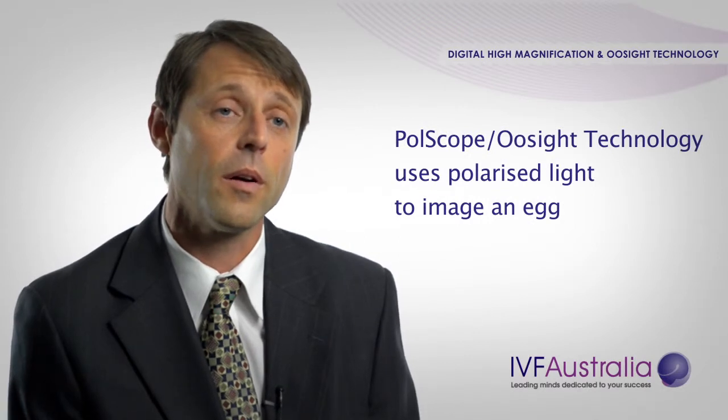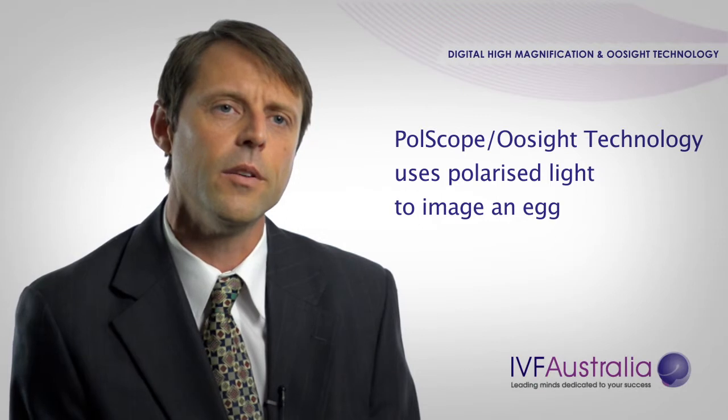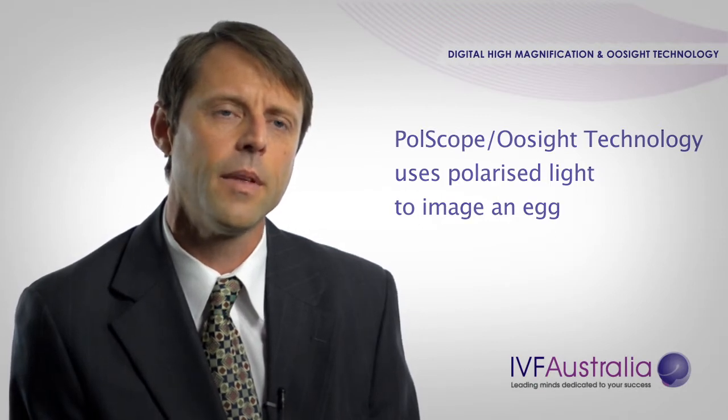PolScope, or Oosight, as the technology is now known, is a software to allow us to use polarised light to image an egg. At IVF Australia, this allows us to see the genetic centre of the egg, called the spindle. The presence or absence of the spindle, or a spindle not formed correctly, gives us information about how that egg will develop. There are two groups of patients that benefit from this type of technique.